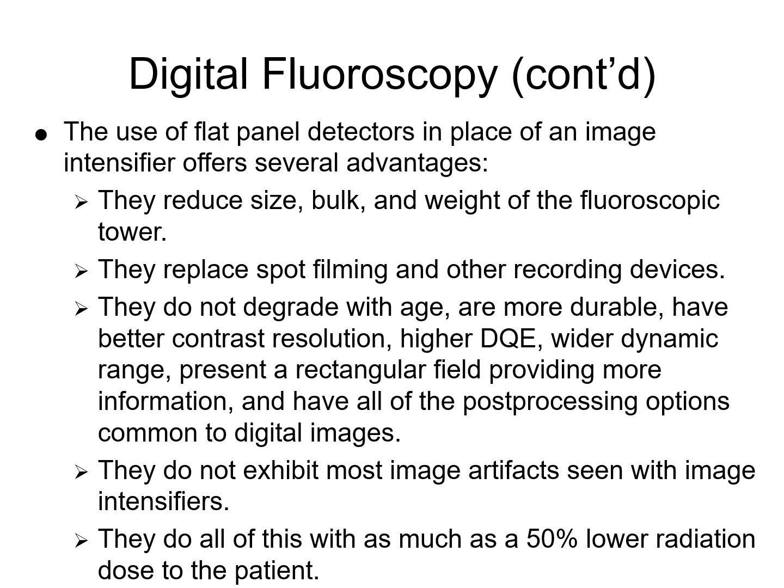And so as digital fluoroscopy is taking over, it's basically about 90% of the way there. We're seeing dose reductions to the patient as we perform these exams versus the same exam that their parents or their grandparents had to go through. A dose savings of 50% is fantastic.